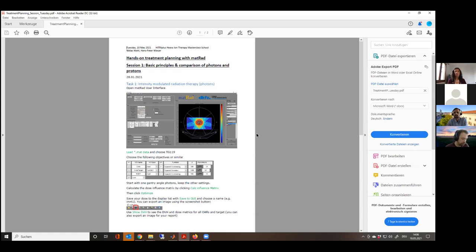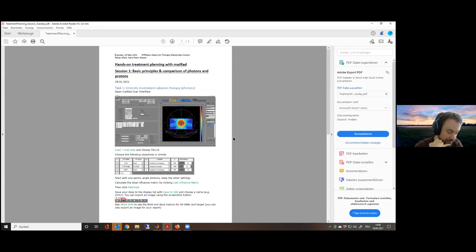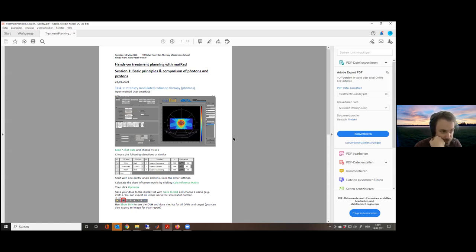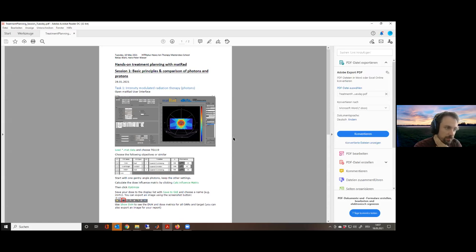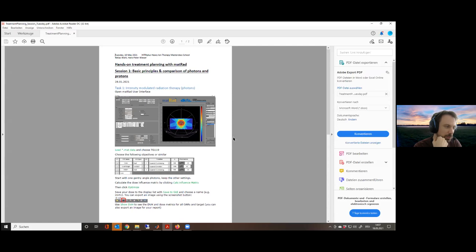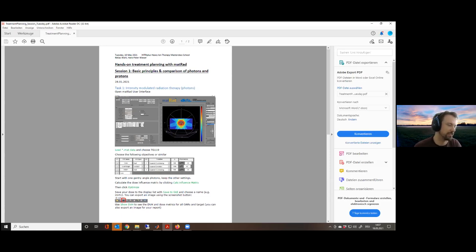To understand why proton and ion therapy is becoming so popular, it's always good to compare to photons — to see how different the plans look and how different it feels to create those plans. I want to remind you that the planning we do is simplistic. State-of-the-art treatment planning methods can become insanely complex, involving automatic beam angle selection and numerous techniques.